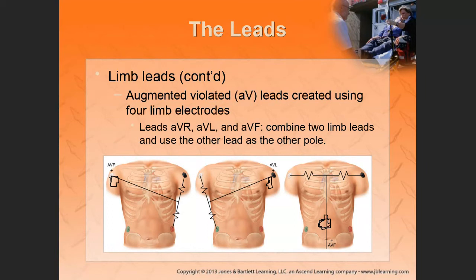Not a complicated question. Don't want to delay moving forward. All right. So Miss Carr, correct. It would be AVL and lead 1. So AVL and lead 1 in a 12 lead ECG as limb leads look at the left side of the heart. We only have one that would look at the right, and if we're doing a 12 lead ECG, which limb leads would look at the inferior portion of the heart?